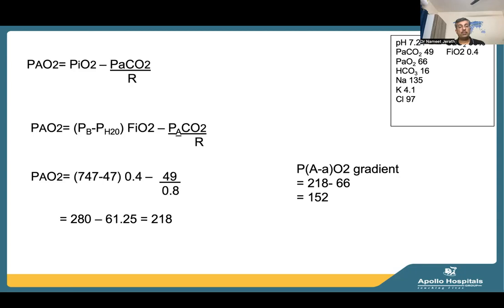So for the blood gas estimation of metabolic disturbances, the acid-base disturbances, the pH, the PCO2, the bicarbonate, and the electrolytes are more than enough to give you an idea, or for you to be able to find out the reason of the disorder.